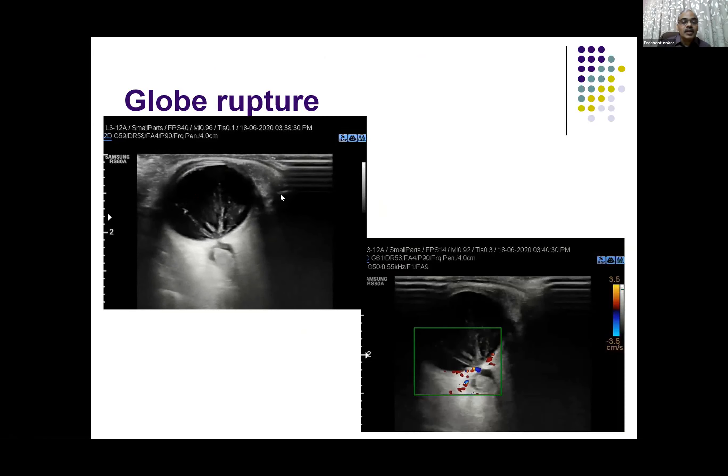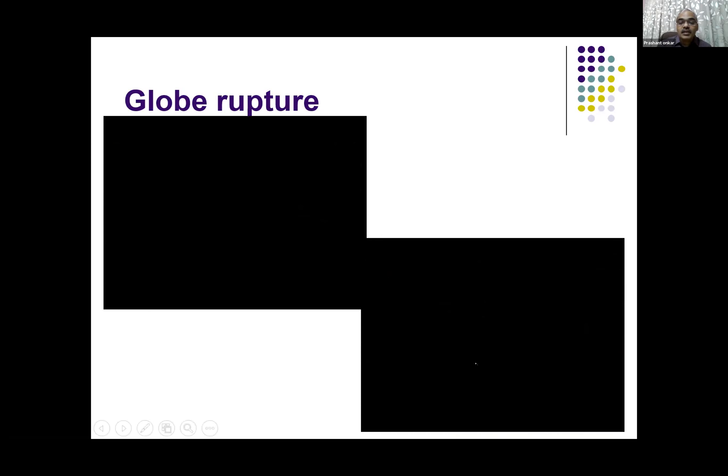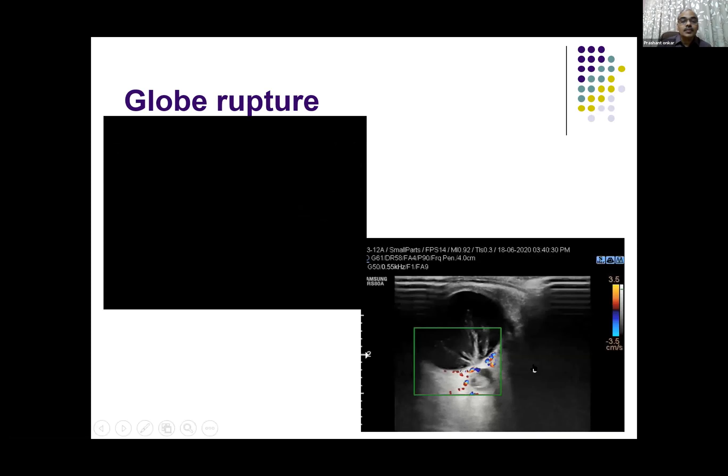This is another case of globe rupture — blunt injury to the eye. You can see there is a defect or break in the posterior aspect of the globe, and the vitreous is moving outside and going around the optic nerve. On Doppler, giving minimal pressure, you can see the to-and-fro movement of the vitreous there. And probably the optic nerve head has also been severed due to the severe injury.